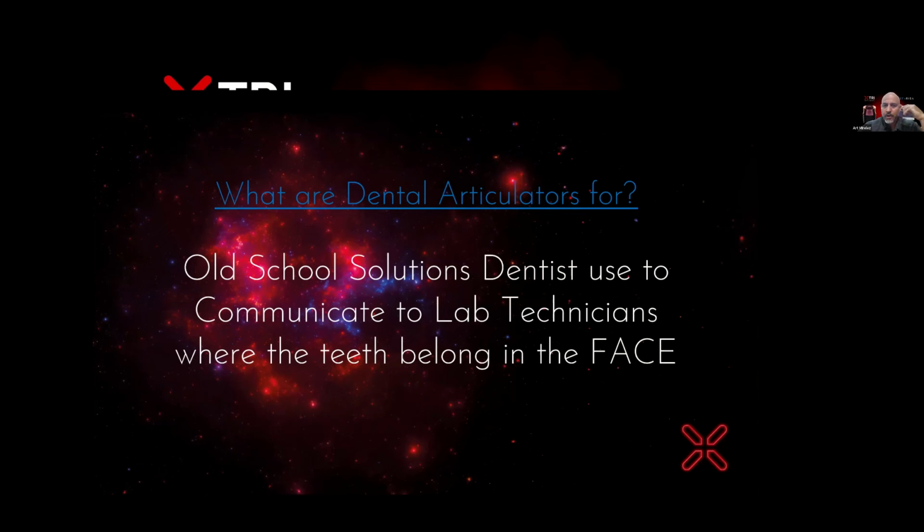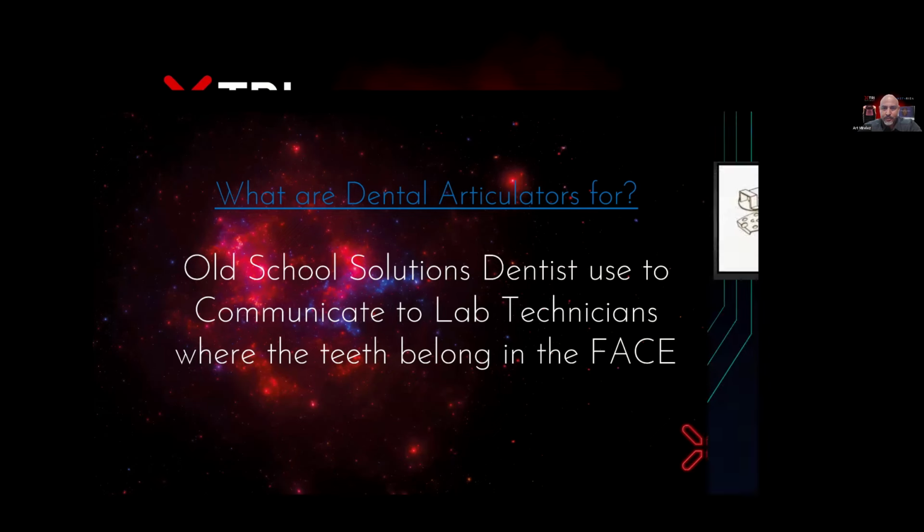So the purpose of articulators is so that the lab technician thoroughly understands where the teeth belong in the face, so that when they're setting the teeth, whether on a benchtop or on a computer, they know more or less how these teeth are going to look when you put them into the patient's face.